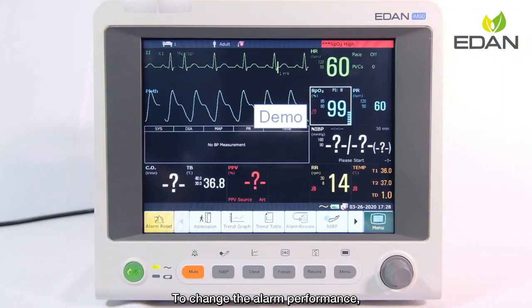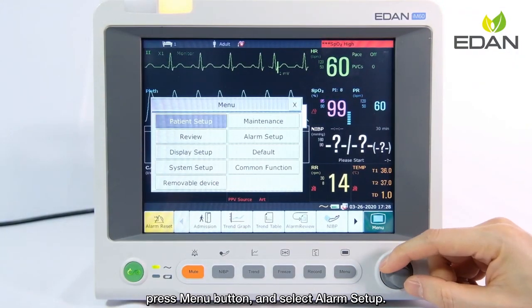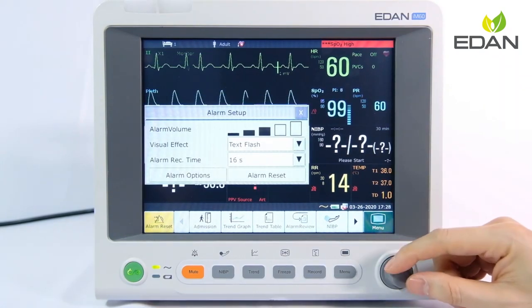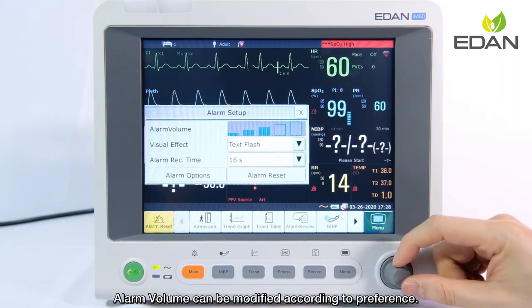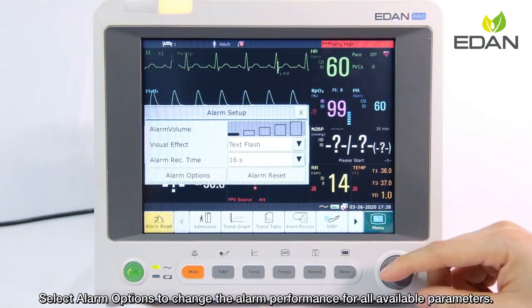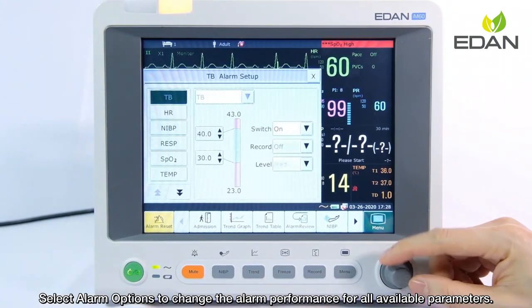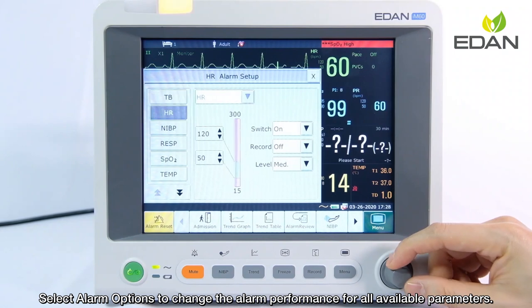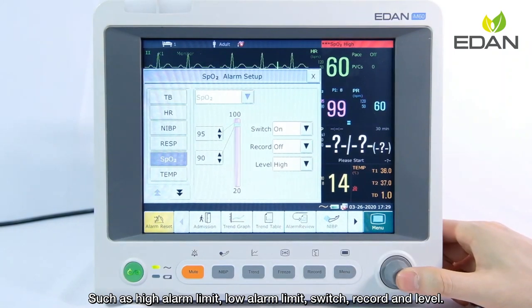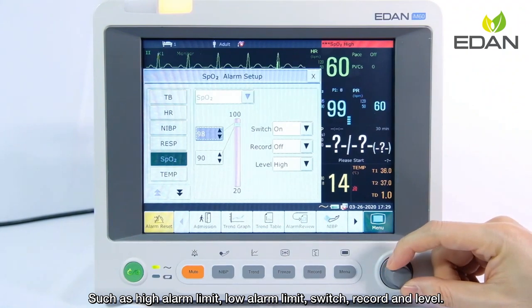To change the alarm performance, press the menu button and select alarm setup. Alarm volume can be modified according to preference. Select alarm options to change the alarm performance for all available parameters, such as high alarm limit.